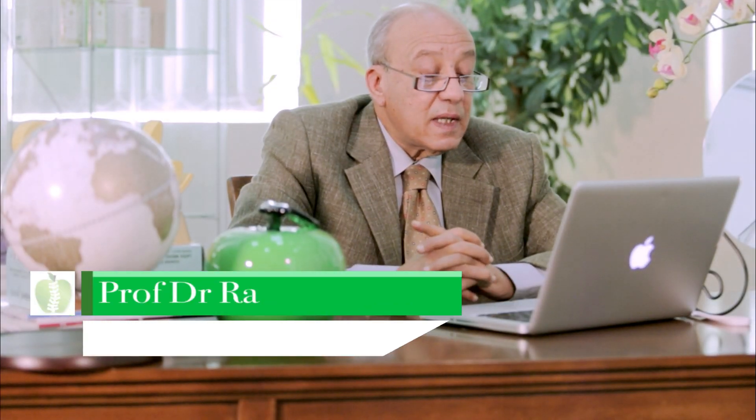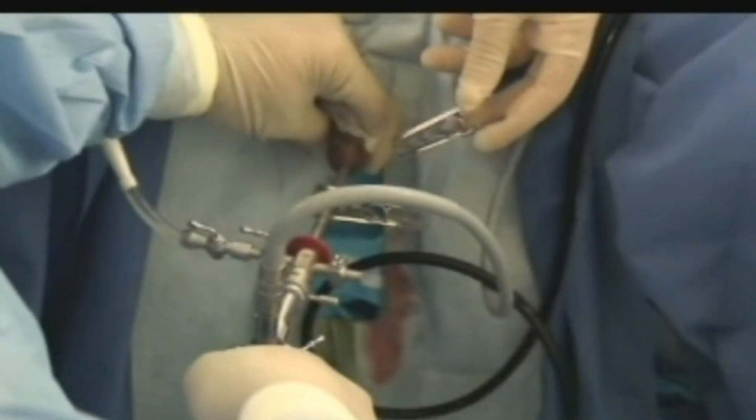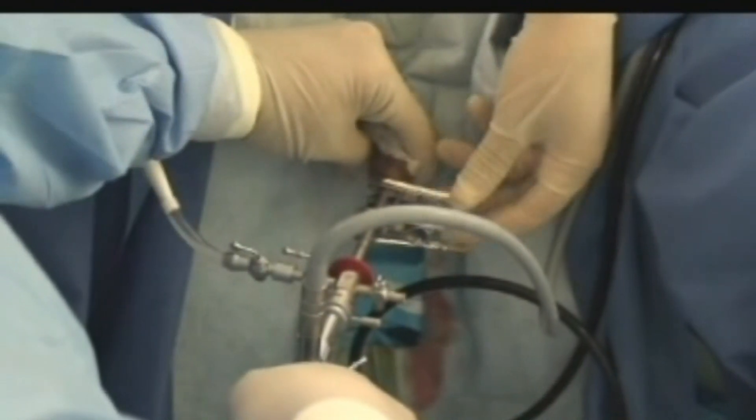This is a prostatic stent fixation under local anesthesia, because the patient is not fit for any other kind of anesthesia. We have to relieve the urinary obstruction by placing an intelligent stent.